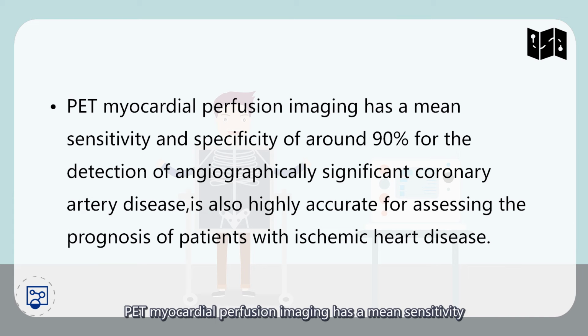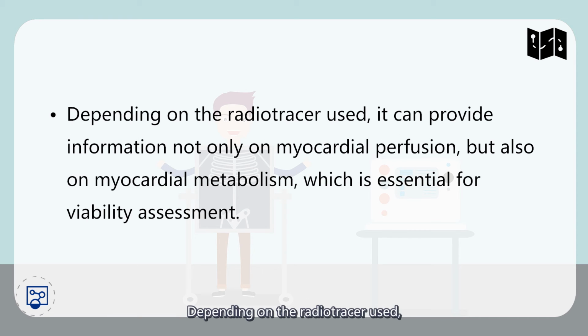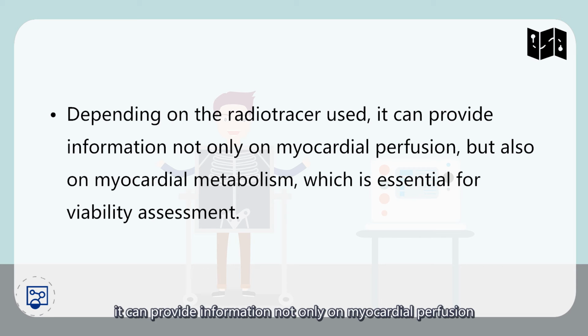PET myocardial perfusion imaging has a mean sensitivity and specificity of around 90% for detection of angiographically significant coronary artery disease. It is also highly accurate for assessing prognosis of patients with ischemic heart disease. Depending on the radiotracers used, it can provide information not only on myocardial perfusion, but also on myocardial metabolism, which is essential for viability assessment.